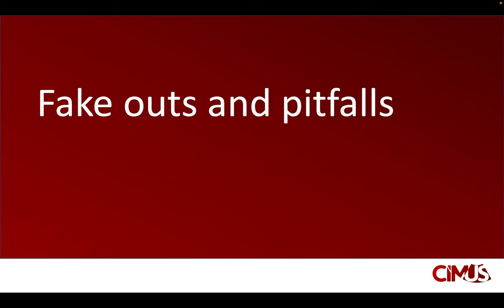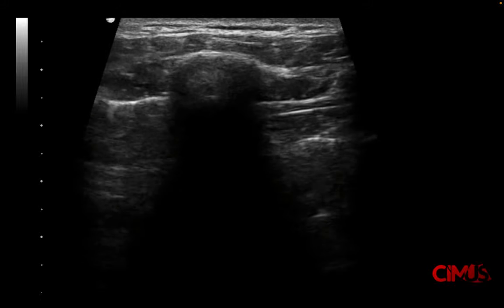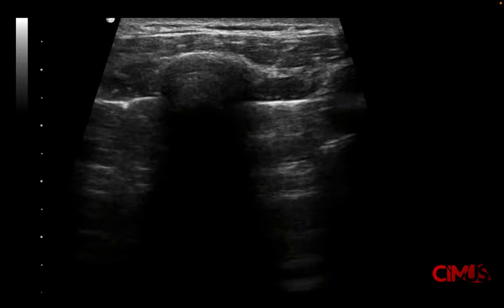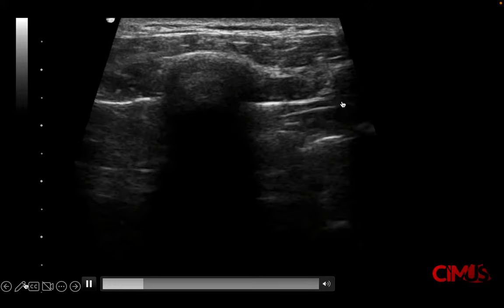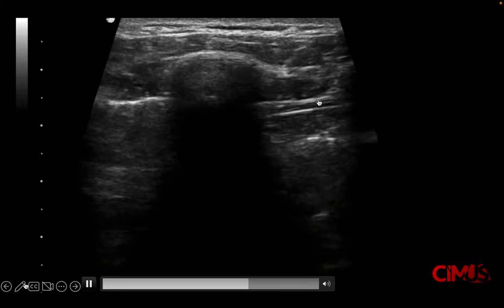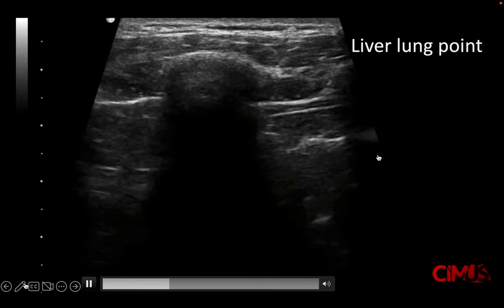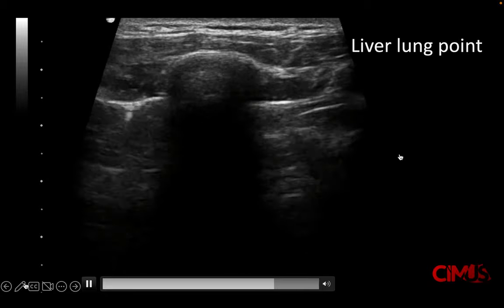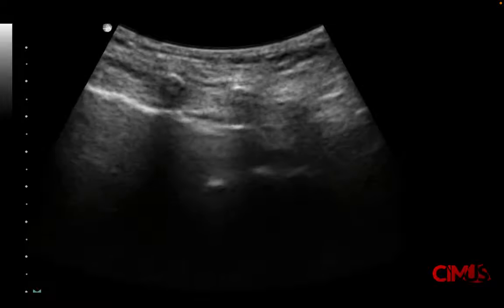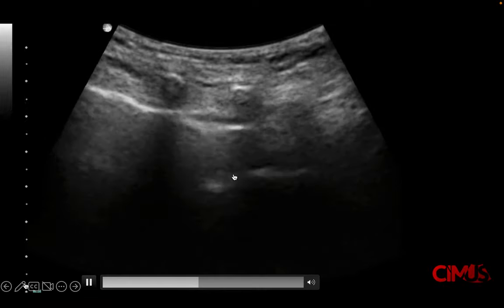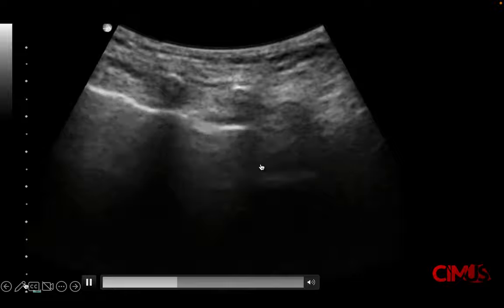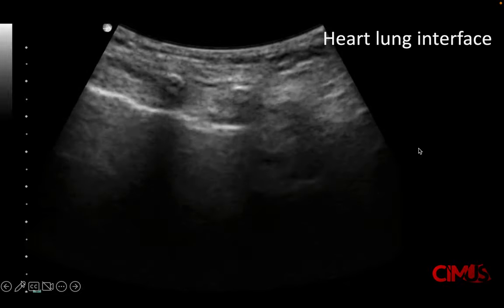It's important to understand potential fake-outs and pitfalls. Sometimes learners look at a lung point and think something looks different from one side to the other — but what they're actually seeing is the diaphragm and liver deep to it. This is the liver-lung interface, which can be mistaken for a lung point. There is also the heart-lung interface, where you see the heart on one side and the lung on the other — don't be fooled by that.